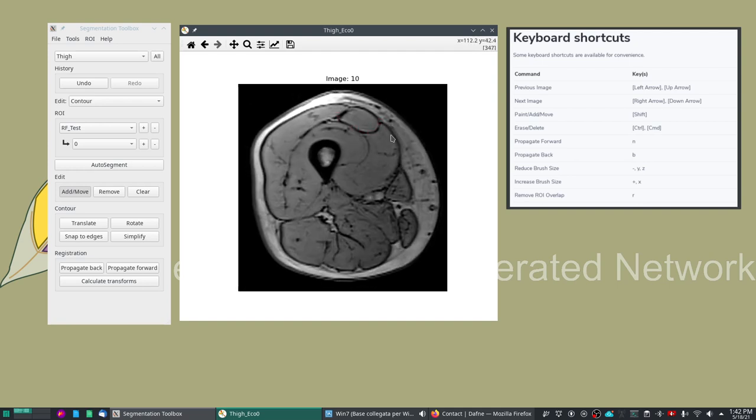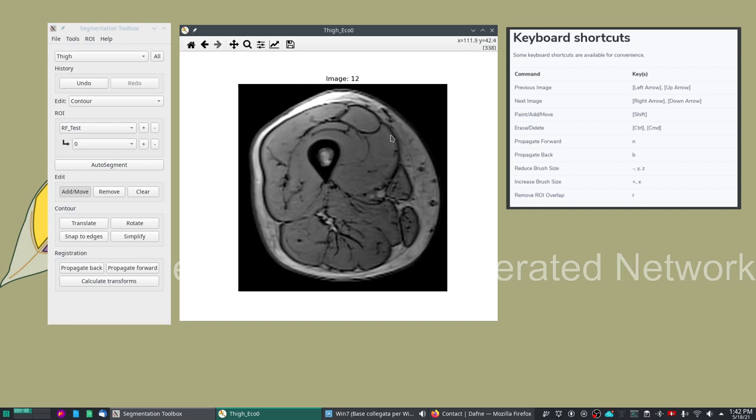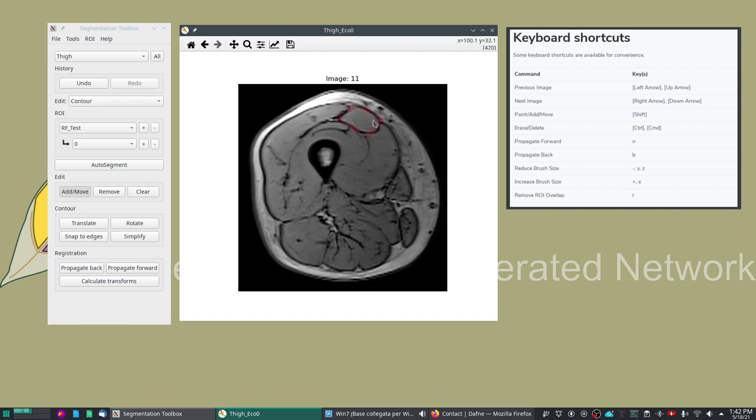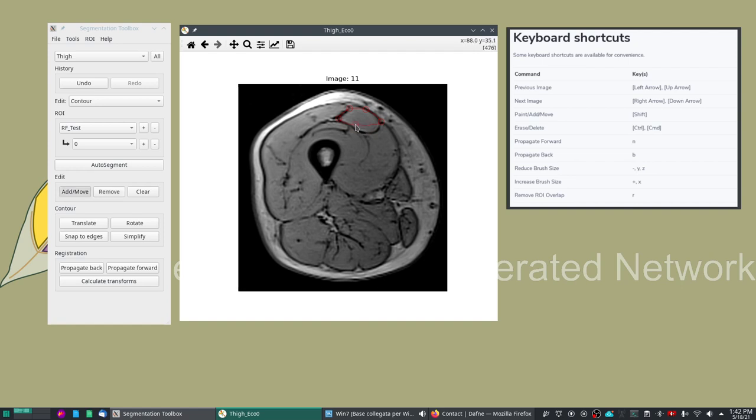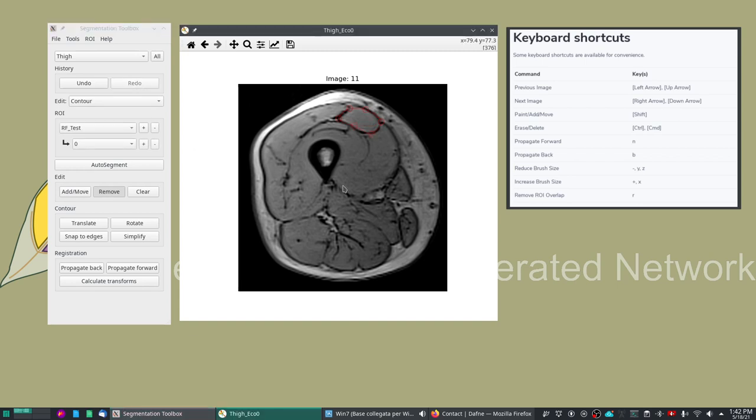To go from one image to the other you can use the scroll bar or you can use the arrows on your keyboard. If you're in remove mode and you temporarily want to switch to add mode then you use the shift button. We also have undo and redo possibility so if we make a mistake you can go back one or more steps.